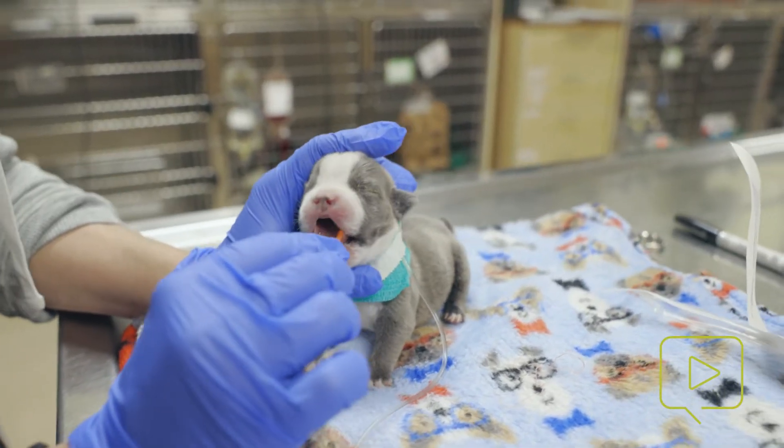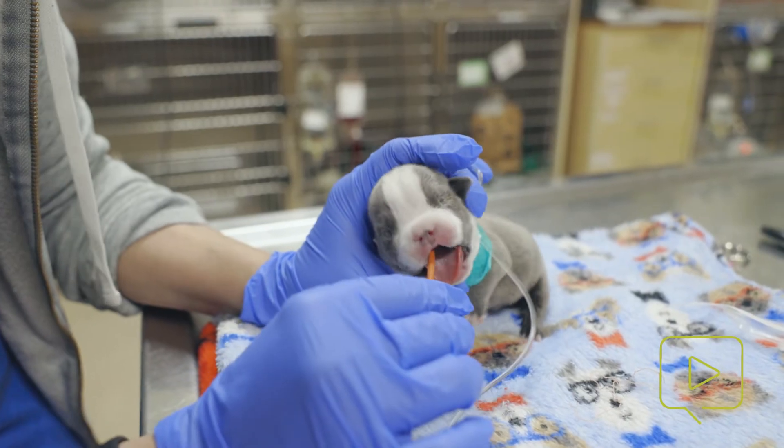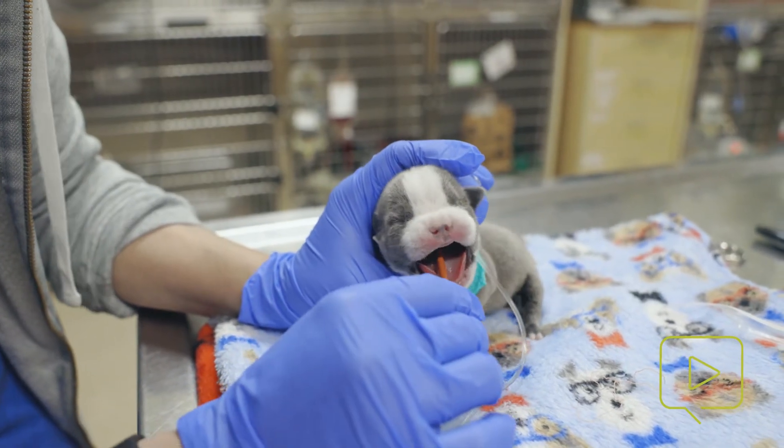You're going to see him do a little bit of gagging, and then eventually he'll swallow it. And once he swallows it, you can start to advance the tube.